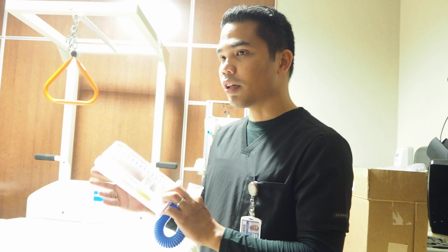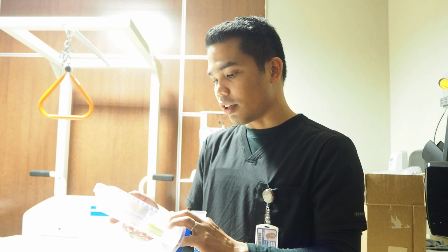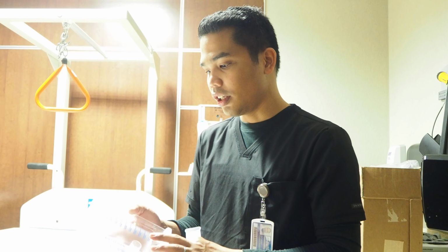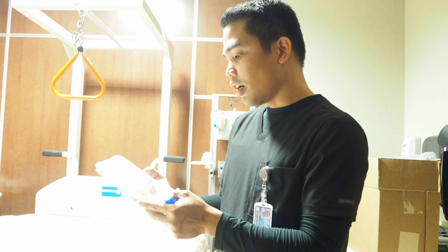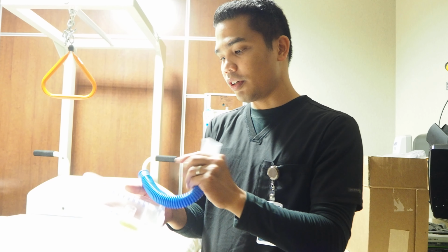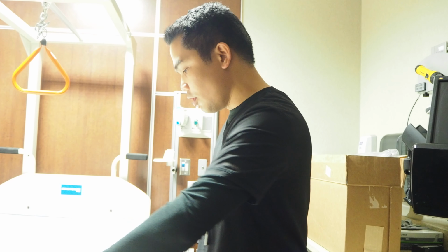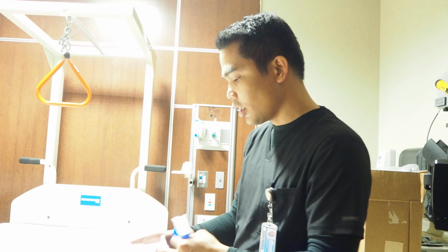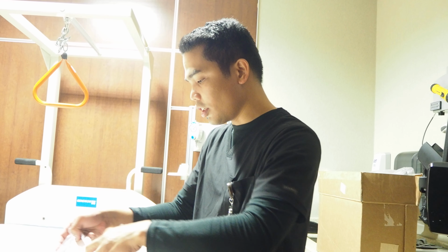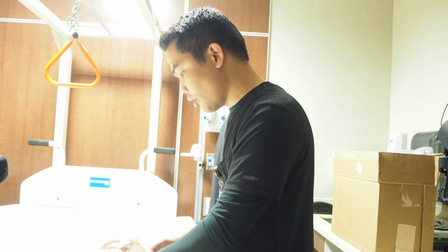And if some patients experience any dizziness or hyperventilation and nausea, please immediately terminate the therapy to prevent any complications. And then once we're done, let the patient cough after performing this therapy. And then when everything's been done, make sure that we return this in the plastic container, and the mouthpiece we cover with a clean tissue, then put it inside.